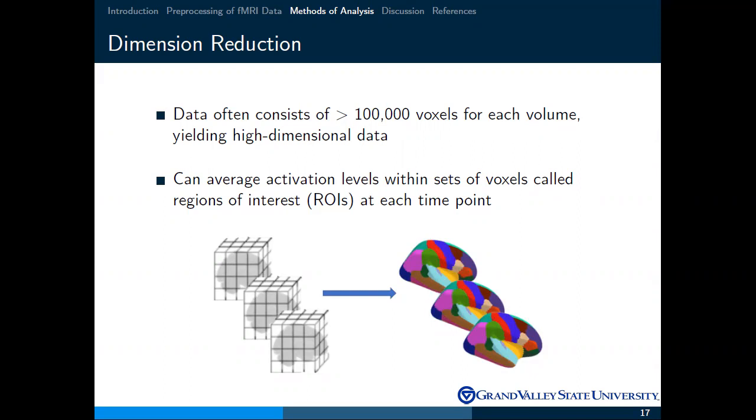But it's based on averages, right? Yes. So if you imagine this volume, we would get repeated measurements across time that result from averaging the voxel value at each time point. Yeah, so you could look at the coefficient of variation. That probably would be informative as well, rather than just looking at the average. Yeah, it's a good point.